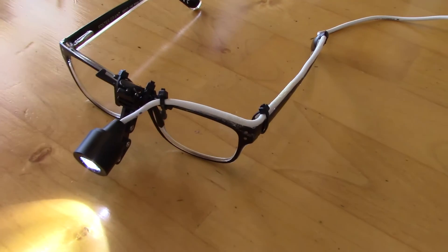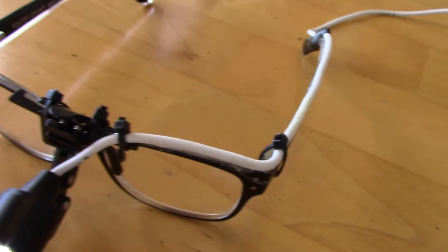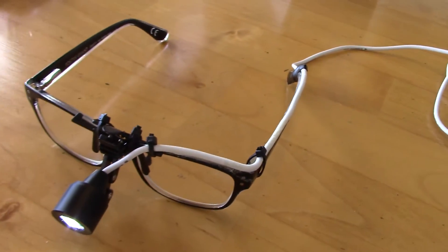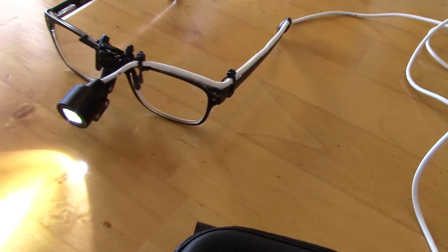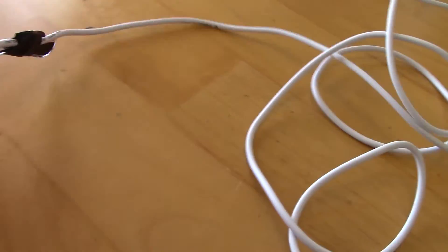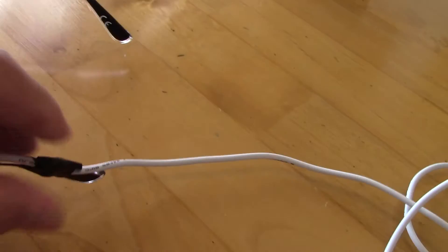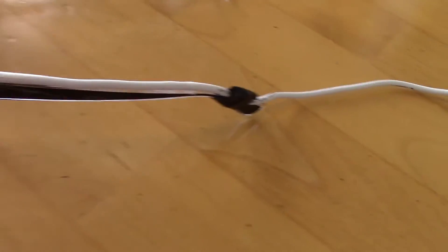Here's the finished product — a very nice bright operating headlight. It's comfortable to wear, unobtrusive, and very lightweight. I did put a little tape at the last zip tie on the earpiece for comfort on your ear.